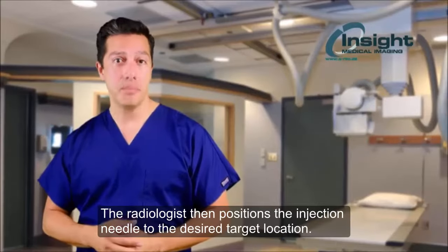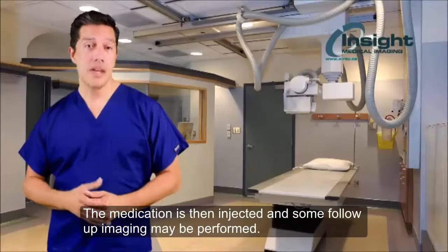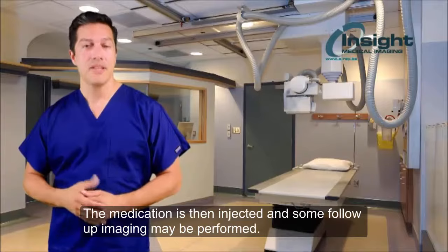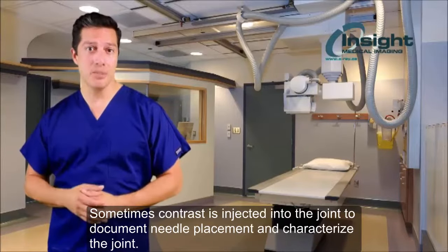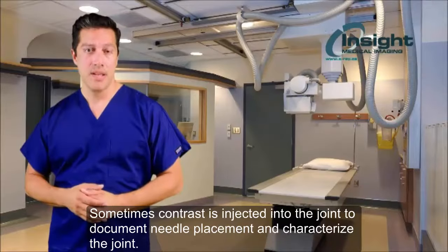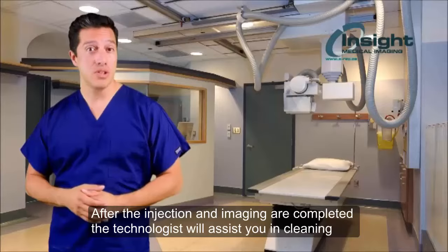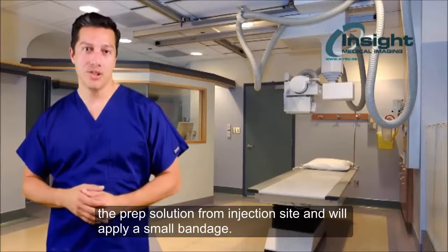The radiologist then positions the injection needle to the desired target location. The medication is then injected and some follow-up imaging may be performed. Sometimes contrast is injected into the joint to document needle placement and characterize the joint. After the injection and imaging are completed, the technologist will assist you in cleaning the prep solution from the injection site and will apply a small bandage.